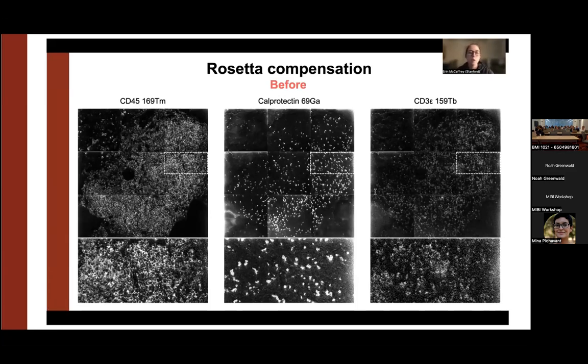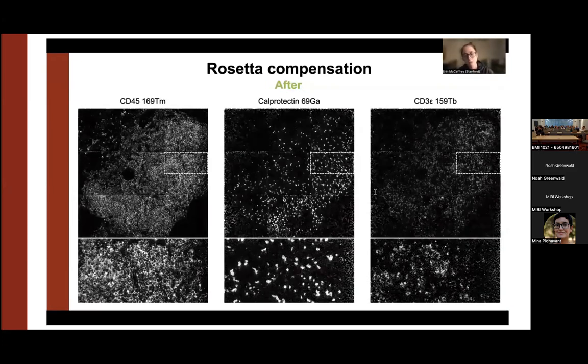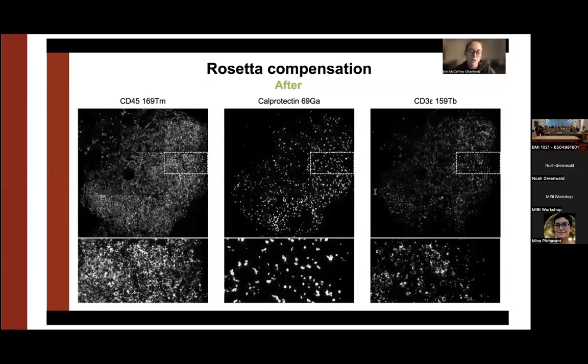And so in this sense, while the first image here makes for a very easy compensation task, these other two can prove to be quite difficult. With previous approaches, this would require us to do quite a bit of fine-tuning or customization of our parameters to make sure that we're accounting for all noise and background while keeping our signal intact. However, here, when I processed these images, I took our Rosetta matrix and applied it in just a single rapid step to produce the resulting images here.